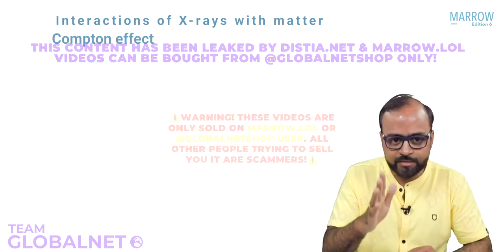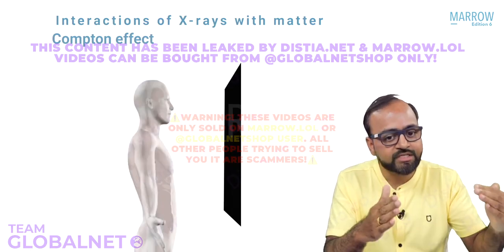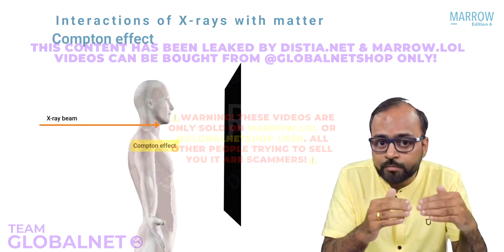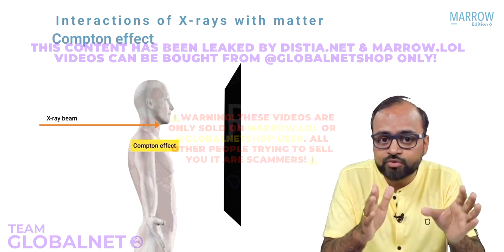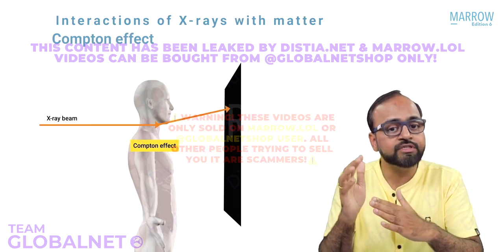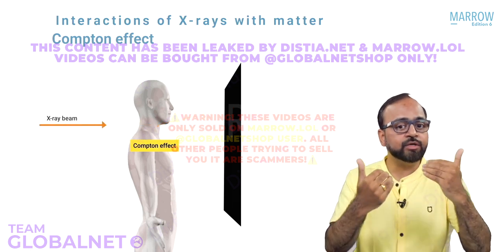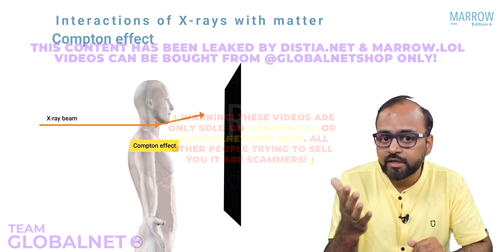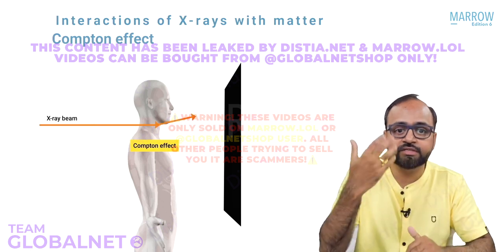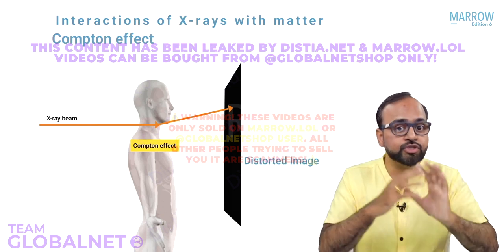See here, just imagine now, right, here is a patient and I am trying to do a cervical spine radiograph. So an X-ray beam is entering into the cervical area or the neck area of the patient's body, but because Compton effect has happened, and in Compton effect what happens to the X-ray beam? It gets deviated. So the X-ray beam will now get deviated, right, and it will reach the X-ray film at this point. Do you realize that an X-ray beam that has entered into the neck region has reached the X-ray film in a region corresponding to the head of the patient's body? It is carrying information from the neck. It has reached the area corresponding to the head on the film. So if I develop this film, I will get a much distorted image.